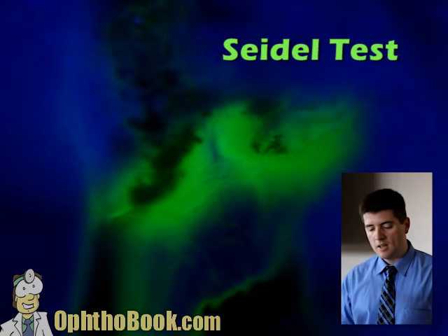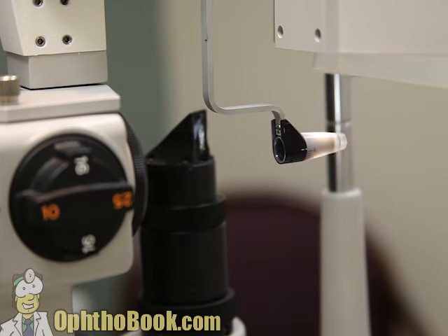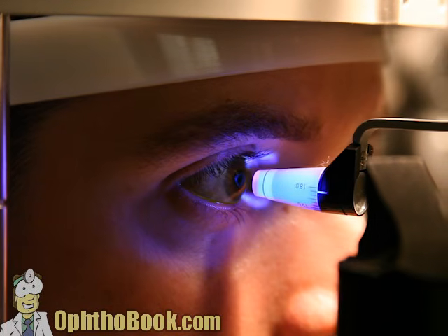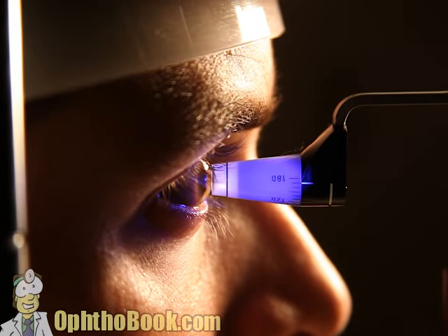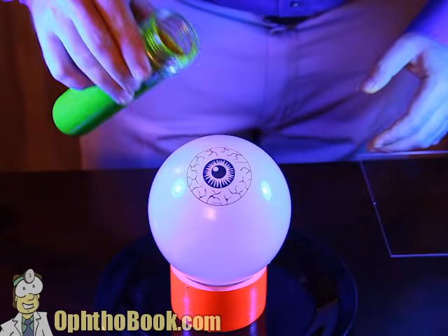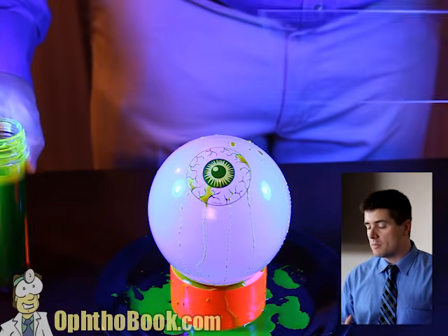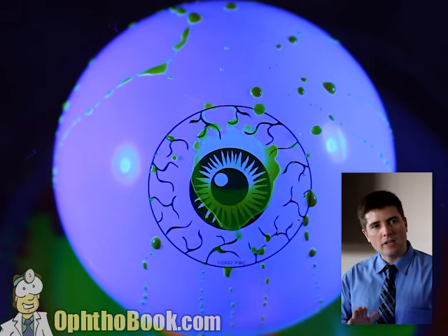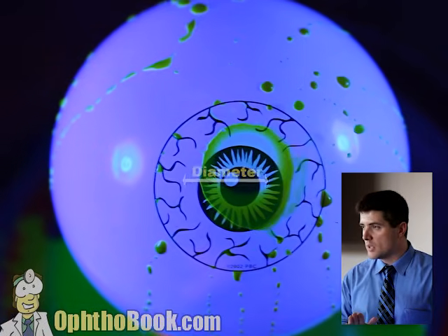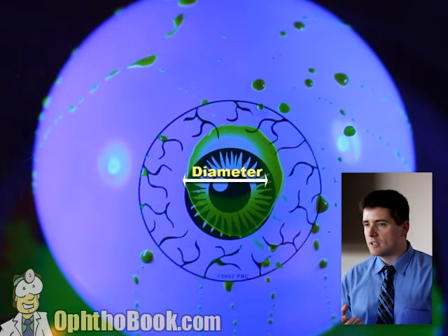The use that we use the blue filter, though, the most, of course, is when we do applanation tonometry, which is when we light up our blue applanation tip, we push it on the surface of the eye in order to estimate the internal ocular pressure. And the way it works is if you have a thin-walled sphere and you push on it with a certain amount of force, the amount of force you use and the area that becomes flattened, which we can measure by looking at our fluorescein mires here, can be used to calculate the internal pressure inside that sphere.